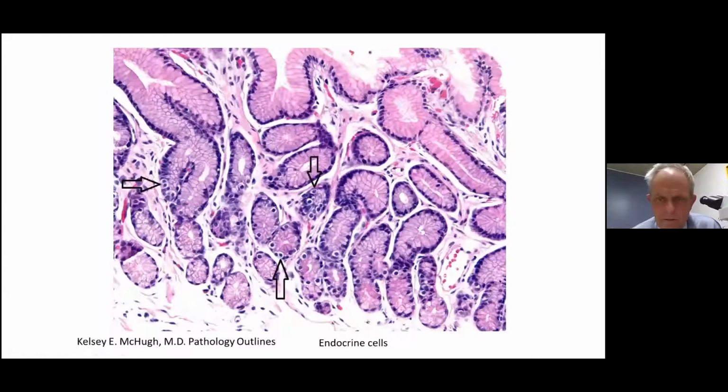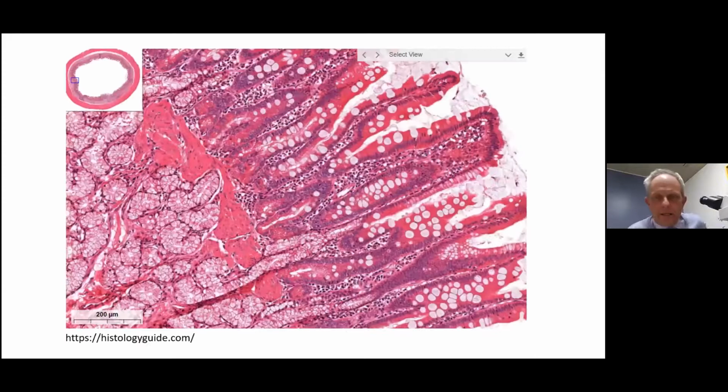Right, so let's have a look now at, oops. Right, so can everybody see that? Perfect. Great. Okay, so what we have here then, we're now moving out of the stomach and into the duodenum. And we're going to see a couple of cases.